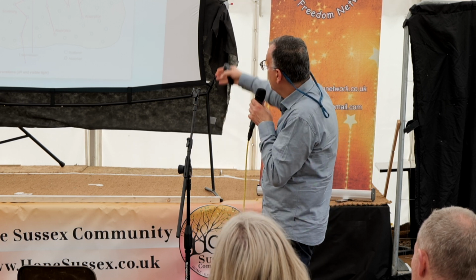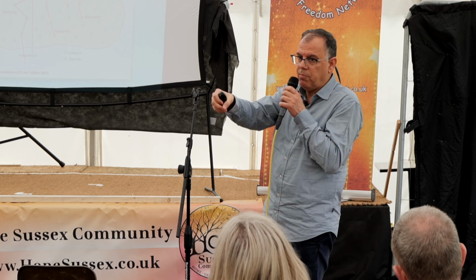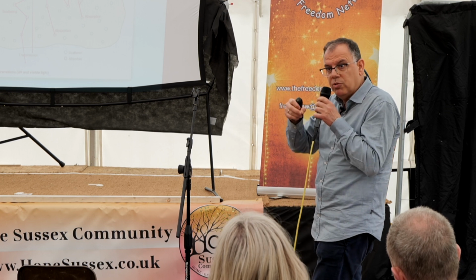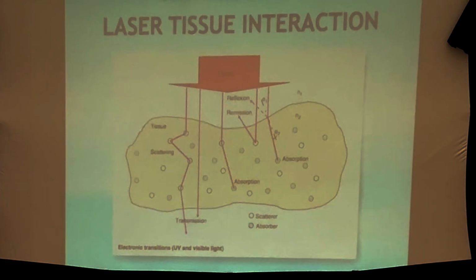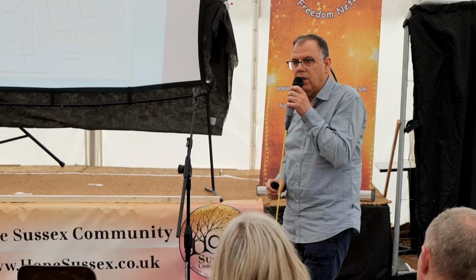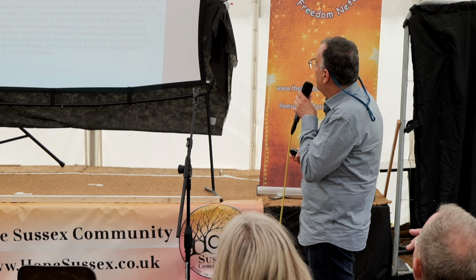It could be absorbed, surface absorption, when you put the tip of the fiber on the tissue, and it could be absorbed, pinpoint absorption, as I said. And then the reflection, this is not good, because if we have a reflection, we don't have any action. Okay? And then the absorption again, which is not straight-ahead absorption, it's like curved absorption of the irradiation. So this is the tissue interaction with the laser.